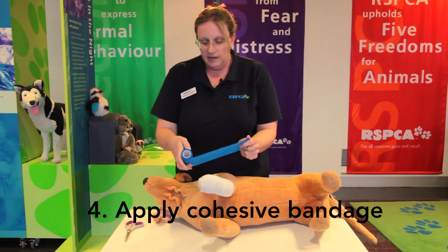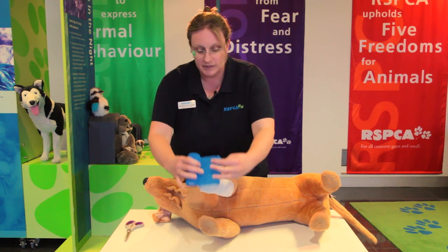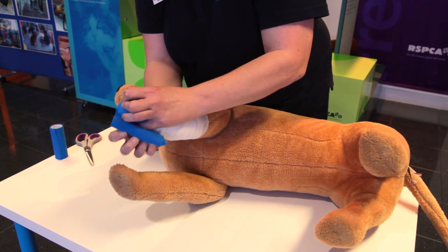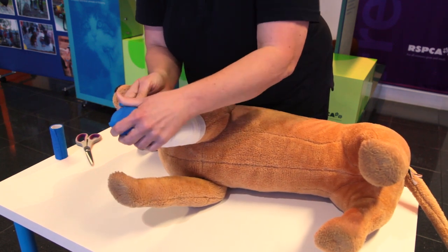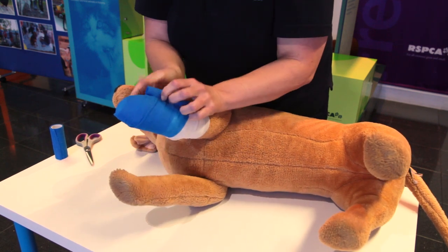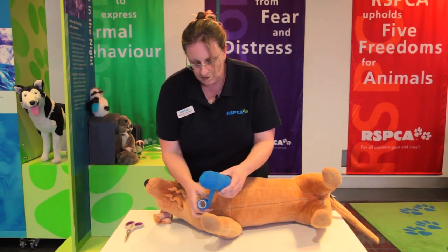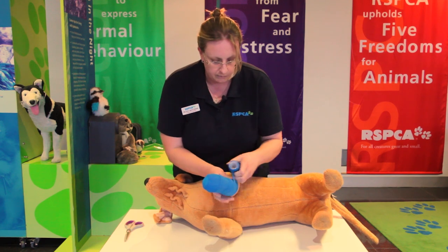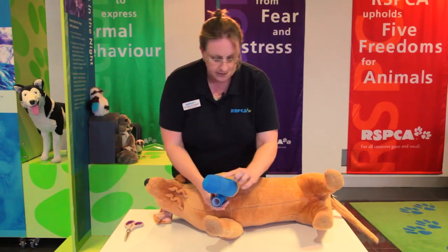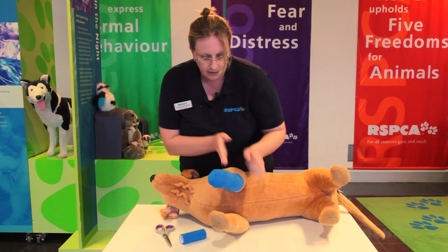We open it up so that we don't have to pull really hard around the dog's limb. I always start with the barrel down so that I can fold it neatly over the top of the paw where the animal won't put pressure on it by standing, and then bring it around. Each wrap covers 50% of the layer before. If you pull too tight, you can end up constricting the limb too much and the circulation will stop. Once all of the underlying layers are covered, we can cut off the bandage.